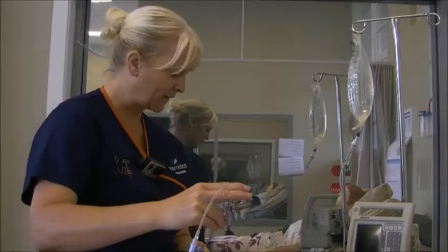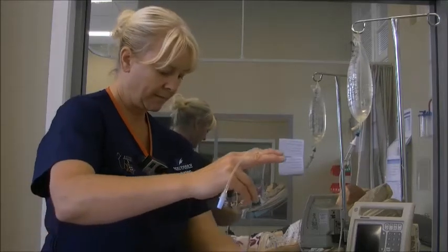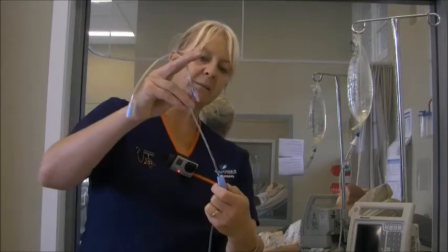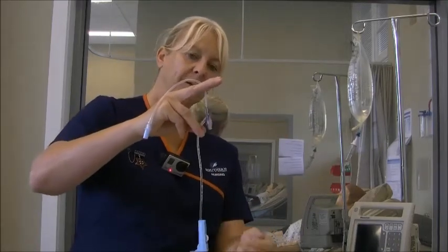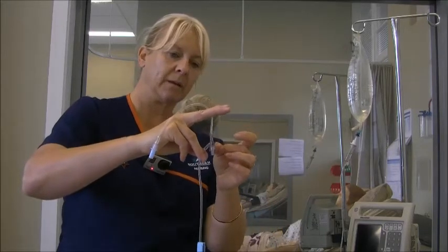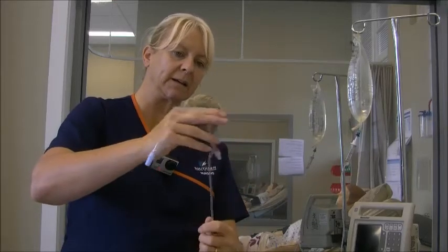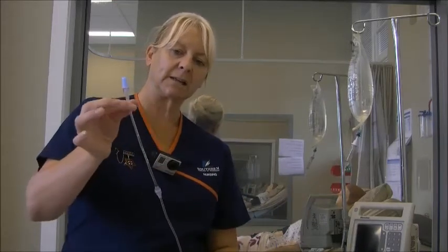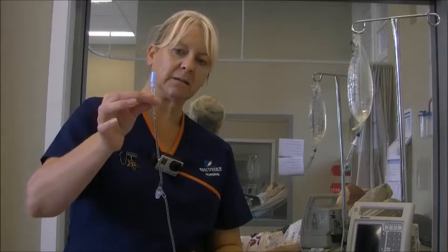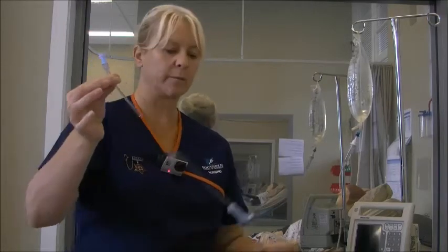I can be a bit quicker now that I know I've got a good hold of the tube. Okay, so it's about there, so I'm going to slow it down a wee bit. And as it comes up past there, I'm just going to flick it so that the fluid goes into that connection and starts coming up the tube. When it gets to the end, I'm just going to turn it off.